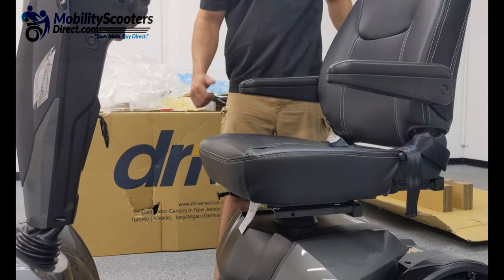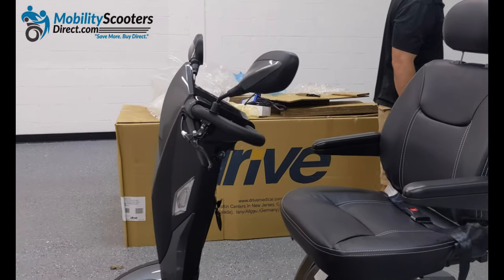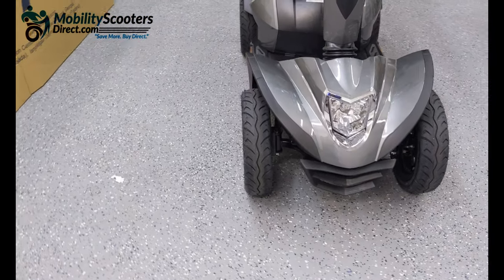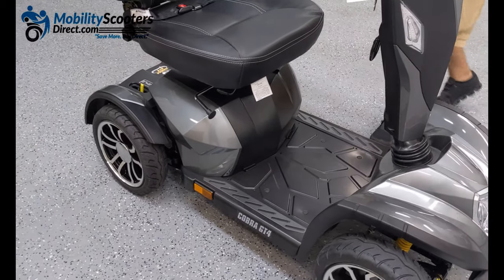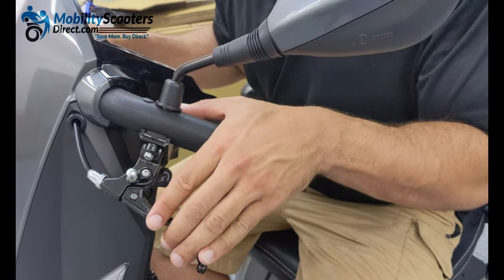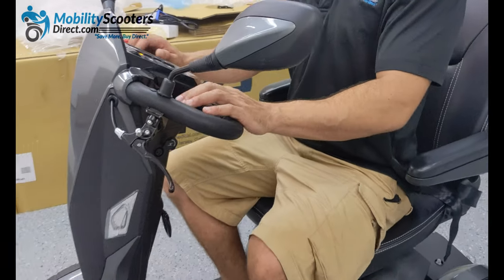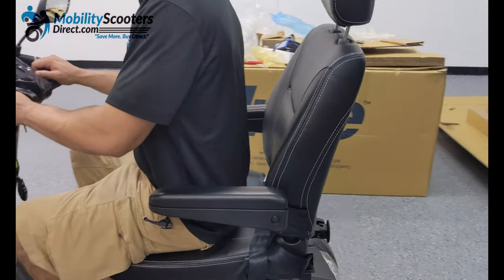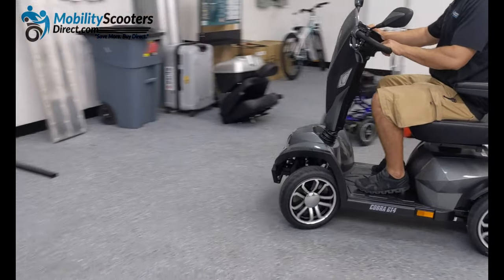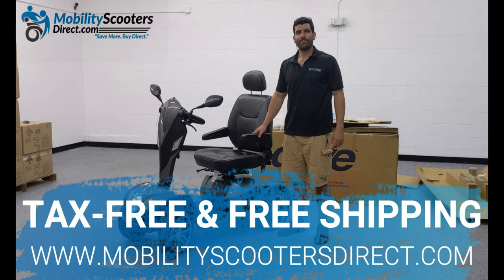You can also tilt the tiller handlebars forward or backwards to bring them closer to you or further away to open up more space. In the front we have a really bright headlight, and you can see the front suspension. There is also a manual parking brake setup — pull it back and then push that silver button down to lock the disc brake into place. It's a disc-style brake that works as an override braking system to the already existing automatic braking system. This scooter will brake automatically when you let go of the throttle, so you don't need to actually use that hand brake. All in all, we highly recommend this scooter — it's tax-free and shipping is free at MobilityScootersDirect.com.